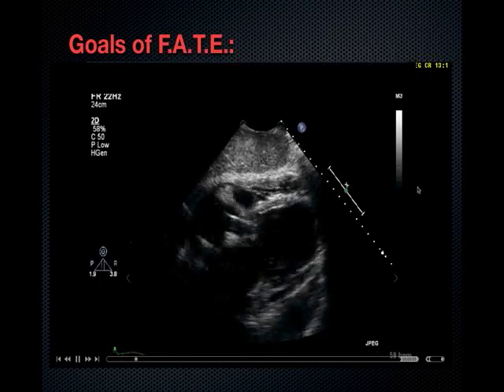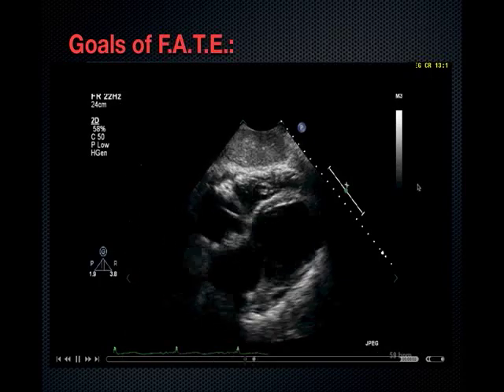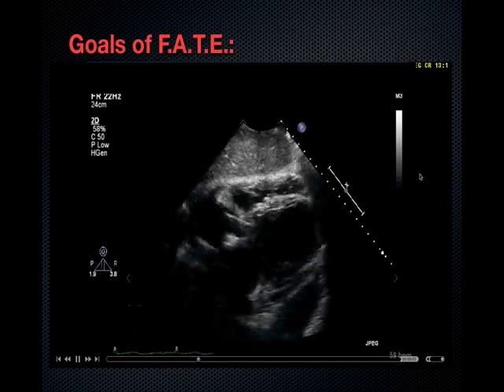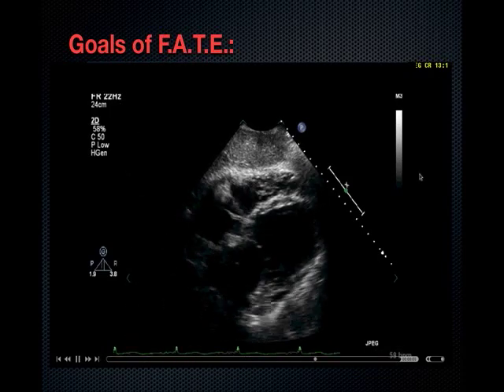So if you found this patient down, knew nothing about them, and ultrasounded them right away, you know they have a cardiac history, a pacemaker, and poor cardiac function. And that does help guide your therapy.